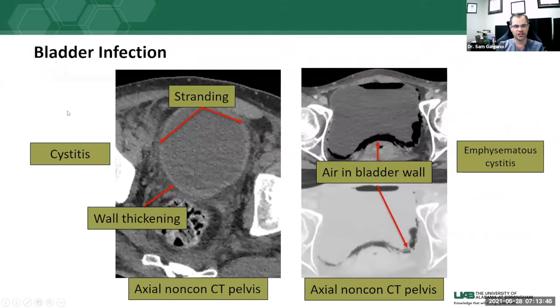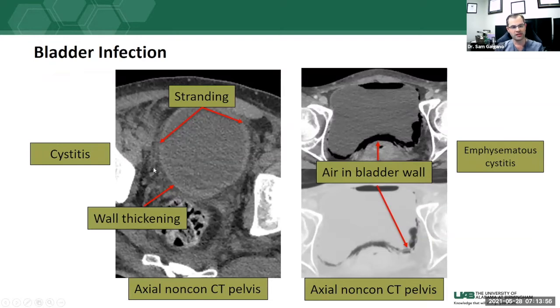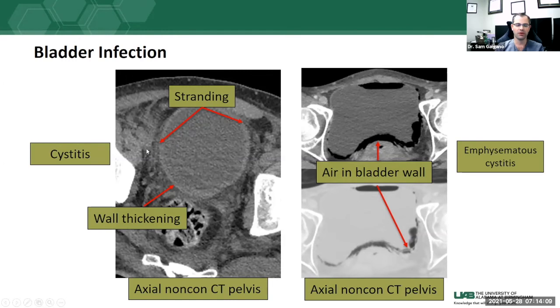Moving on to bladder infection — what does cystitis look like? On a non-contrast CT of the pelvis, typical cystitis shows stranding surrounding the bladder and bladder wall, with wall thickening as seen in inflammation elsewhere in the body. This is pretty typical uncomplicated cystitis, which can be infectious, from radiation, or from any number of causes.